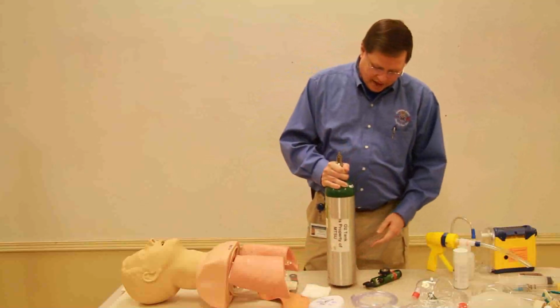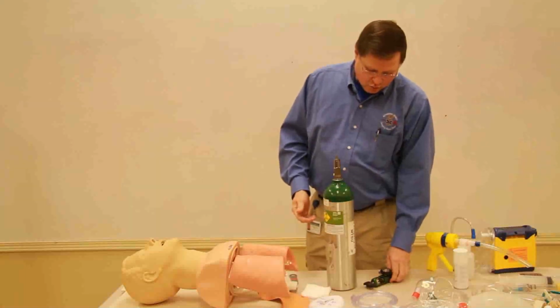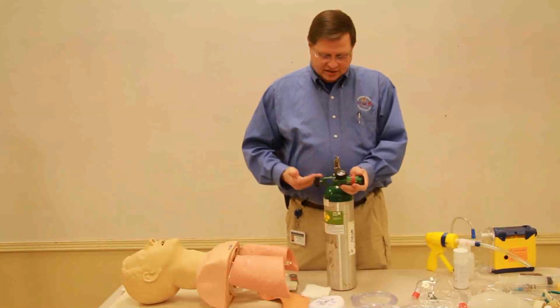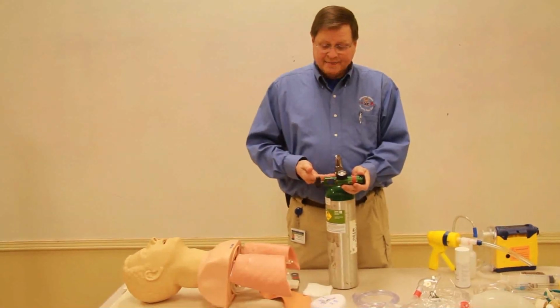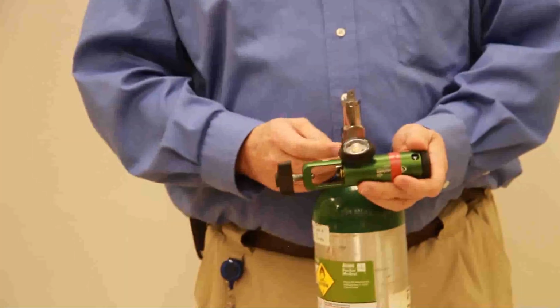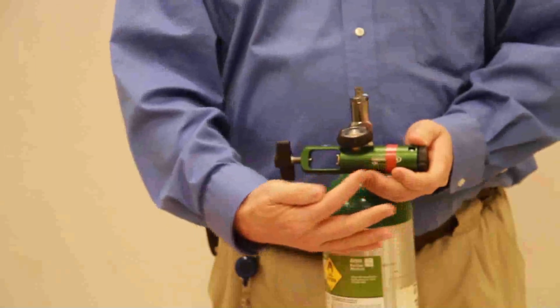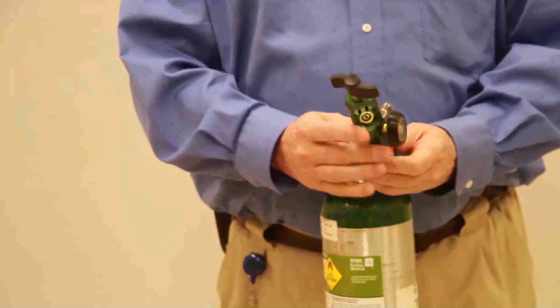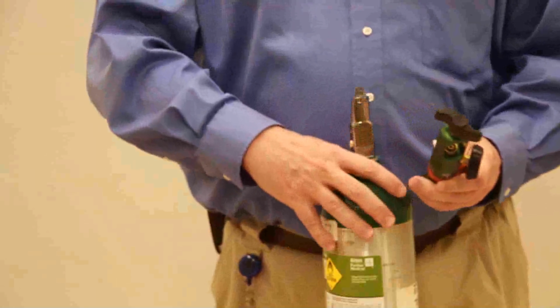Now, when I set up my oxygen in the morning, I want to make sure that I have a full tank. So what I'm going to do is I'm going to put the oxygen regulator on the tank. The tank is set up at about 2200 PSI. Now, if we gave a patient 2200 PSI, that would be a lot of oxygen in a very short time. So what the regulator does is it actually brings it down to a usable PSI that we can actually give our patient.